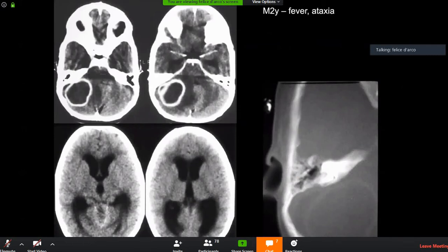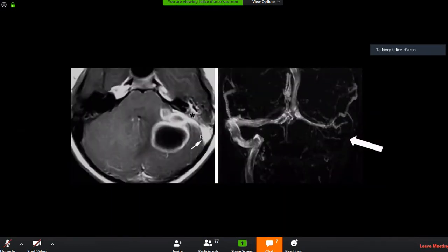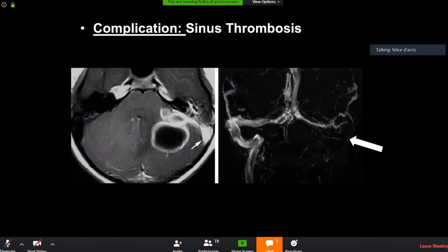Between the layers there is the venous sinus, so you need to look for the venous sinus. In this case it would be appropriate not only to do contrast but maybe to call back the child and do a CTP. CT venography is important because you can have inflammation in between, and this MR can reveal thrombosis of the sinuses as a complication of mastoiditis.